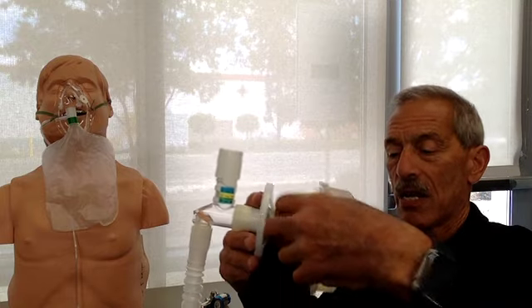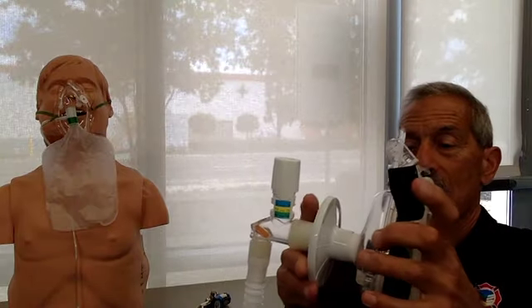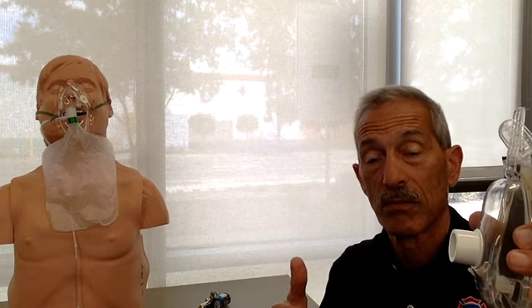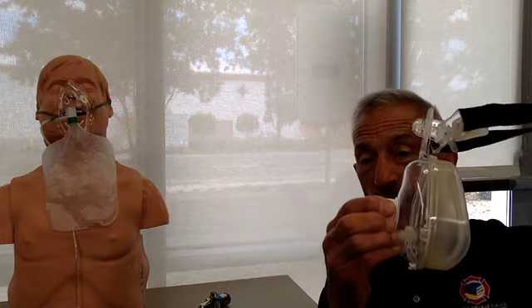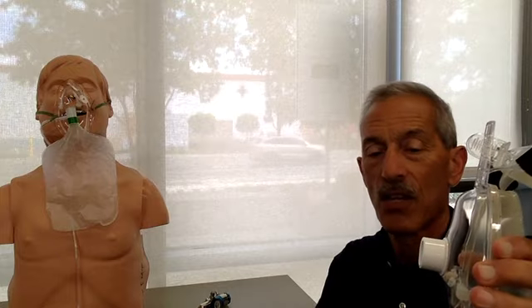So in that case, what you're going to do, and this is a really important step, remember, this is on the patient's head. It's being held in place by all these lovely Velcro straps. And this person is no longer breathing. They're unconscious, semi-conscious. Pull everything off. Get it out of the way. Turn off the oxygen. Grab a BVM and stick the BVM right into this port right here. Don't take the mask off. The mask is secured on this person's face. It's got a great seal. You don't have to worry about CE grips or anything like that. Just stick the BVM right in here and start ventilating.